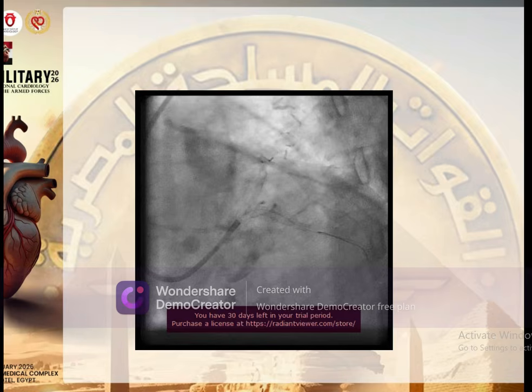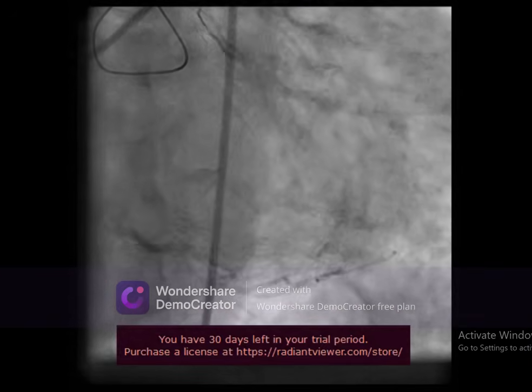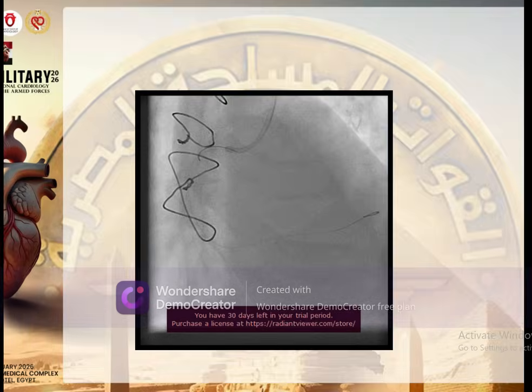As we see here, the flow became more prominent, and fortunately the retrograde collaterals became more prominent, showing clearly how the distal RCA is big and branched. So I don't know why I had the courage to proceed with opening the native RCA.